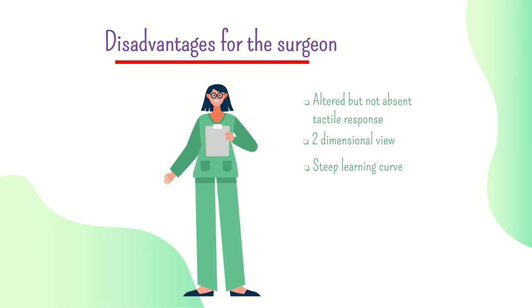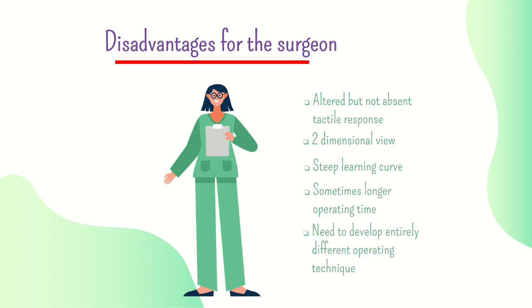As my boss used to say in every surgery, there is no easy case in laparoscopy, and that we shouldn't underestimate any surgery. We should always prepare for the worst. Surgeons sometimes have a longer operating time in laparoscopy. This is sometimes caused by their need to develop different operating techniques than what they normally practice in open surgery.